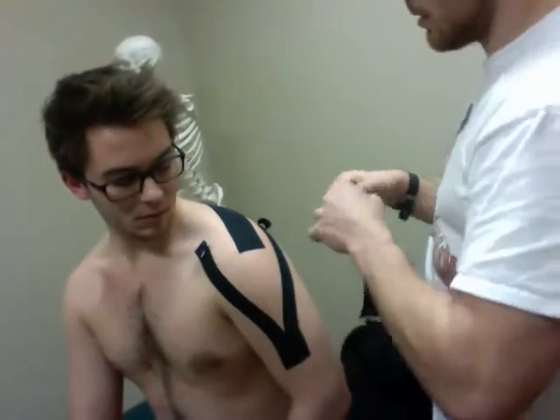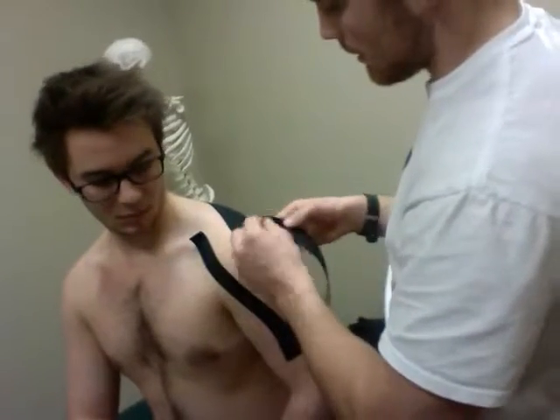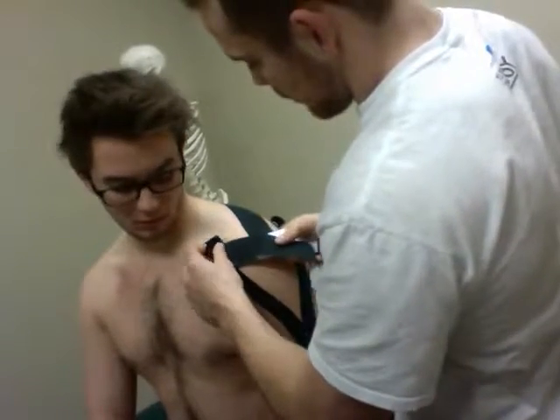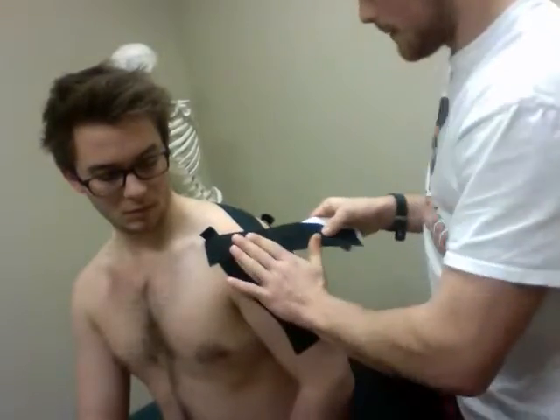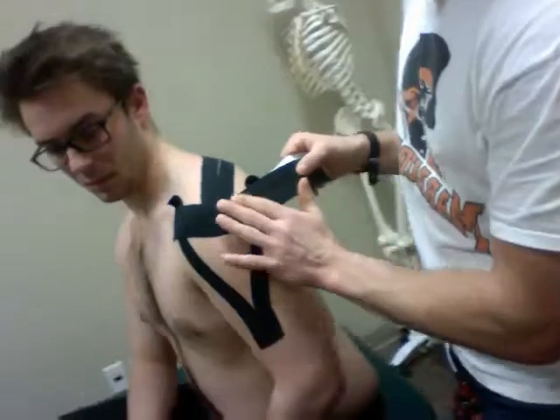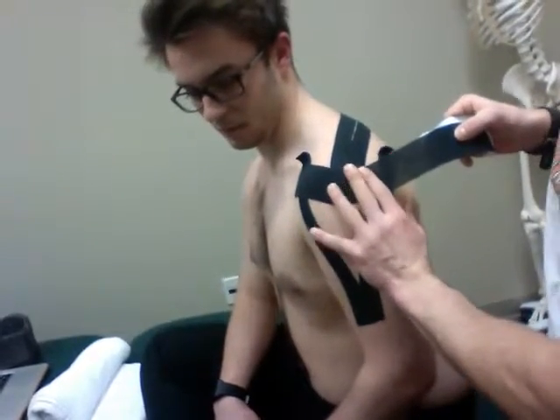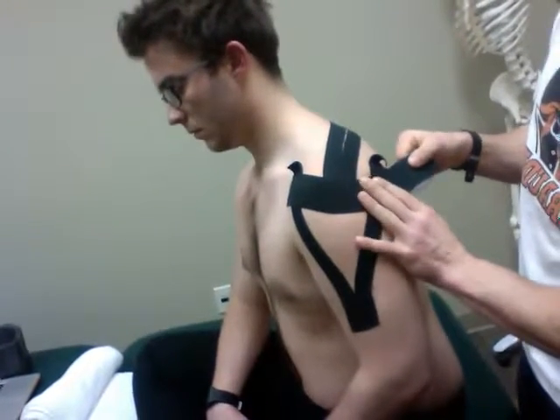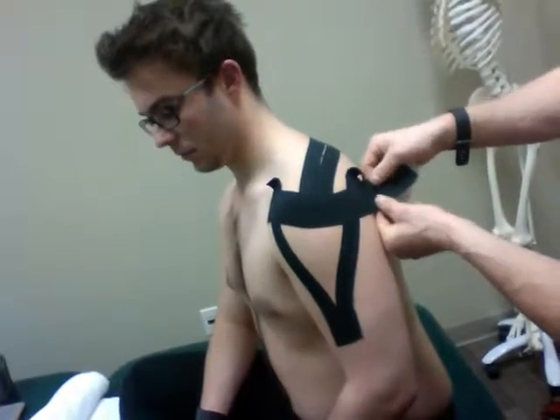I'll anchor my tape on the coracoid process — I would, if I had additional time, cut these little extra strips off. I'm applying this to the coracoid, and then coming around here on the humerus. When we get to this point, I'm applying about a 50% stretch — so out of a total 100%, I'm going about 50% — and applying a downward force. Then coming across, taking tension off, and I'd cut this extra piece off.